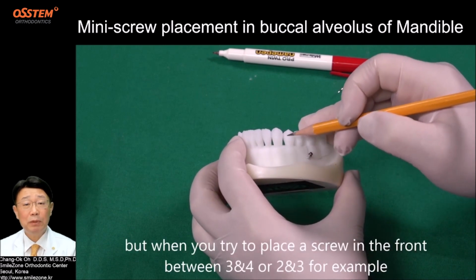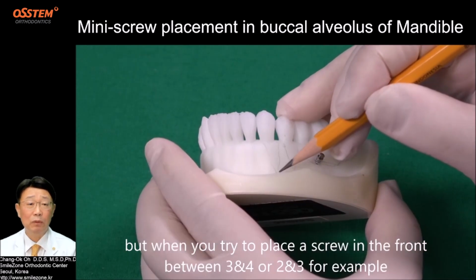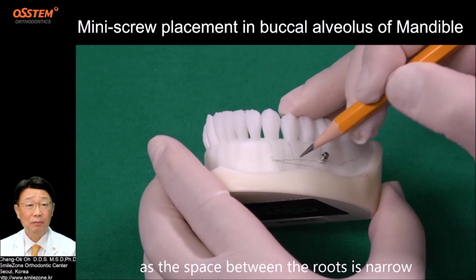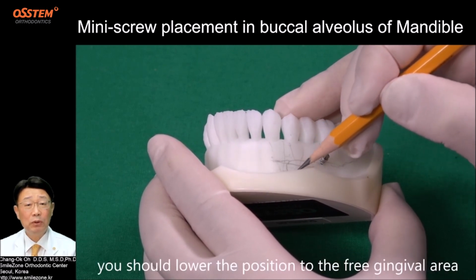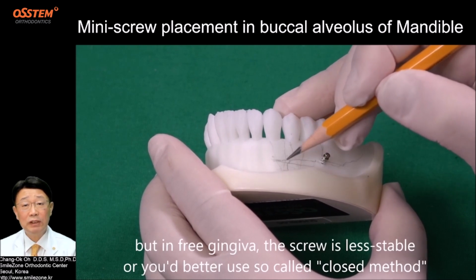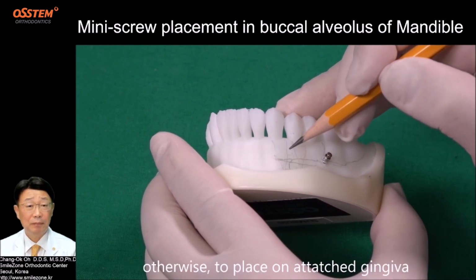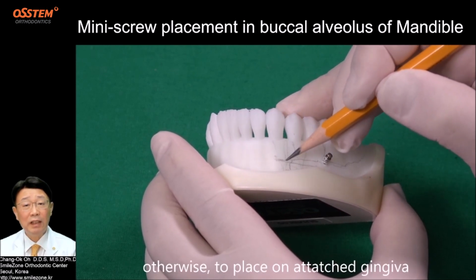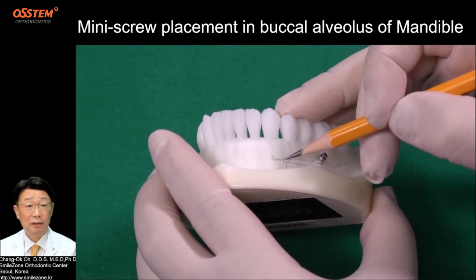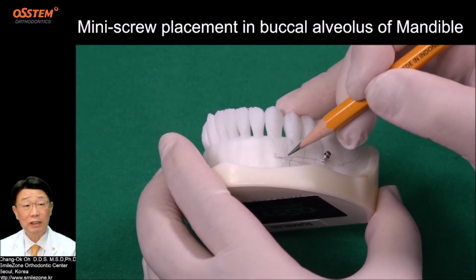But when you try to place a screw in the front, between 3 and 4 or 2 and 3, for example, as the space between the roots is narrow, you should lower the position to the free gingival area. But in free gingiva, the screw is less stable, so you'd better use the so-called closed method. Otherwise, to place in the attached gingiva, you should choose screws with small diameter, 1.4 or 1.2 millimeter in diameter rather than 1.6 millimeters.